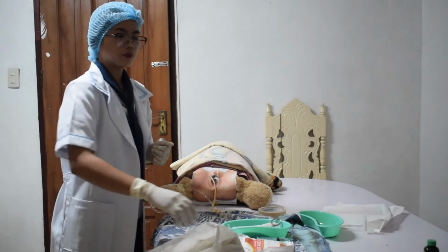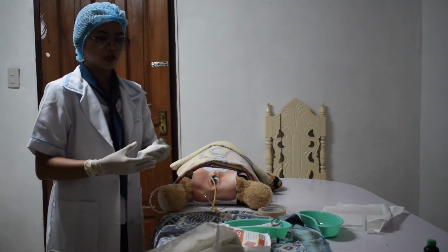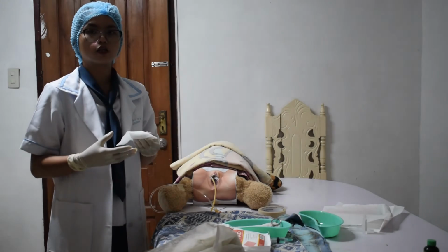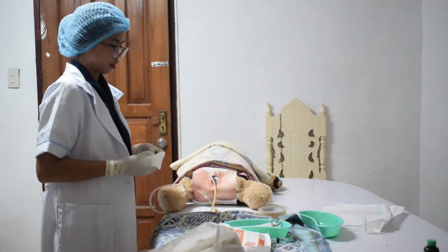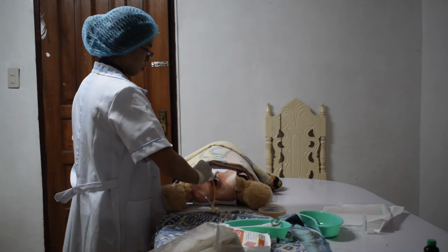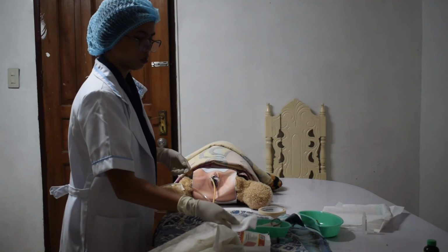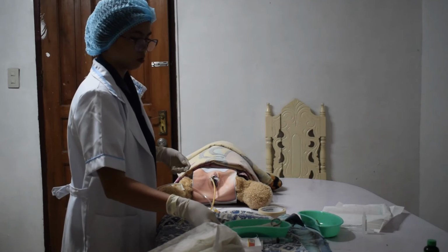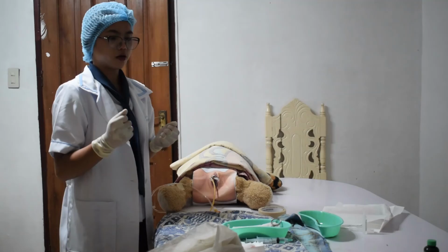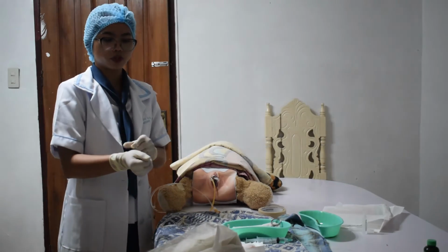Use the gauze pad to wipe the perineal area of any remaining antiseptic and lubricant, and replace the skin of the retracted labia. Remove one glove, cover the genitals, and place the client in a comfortable position.